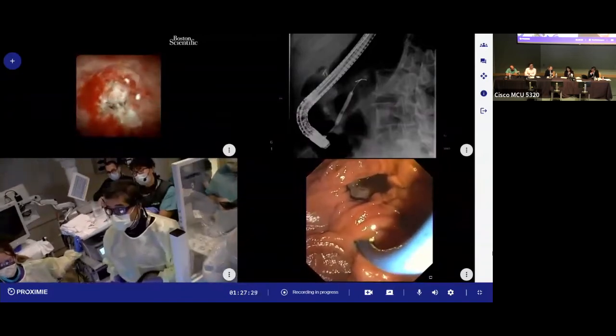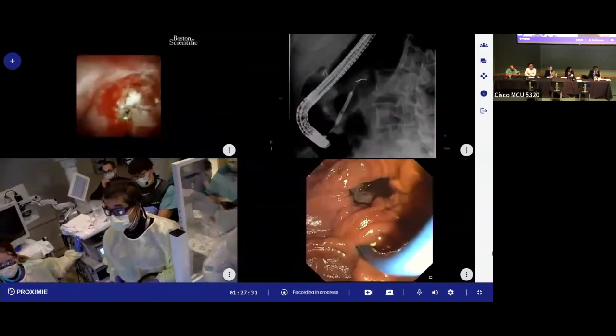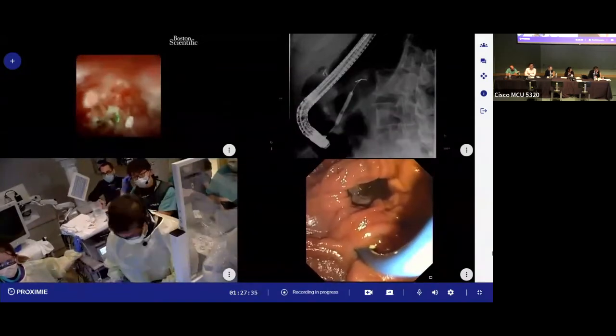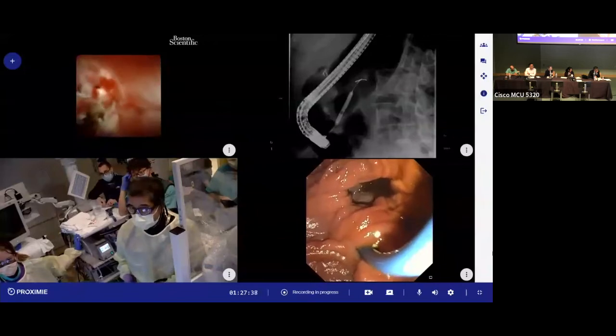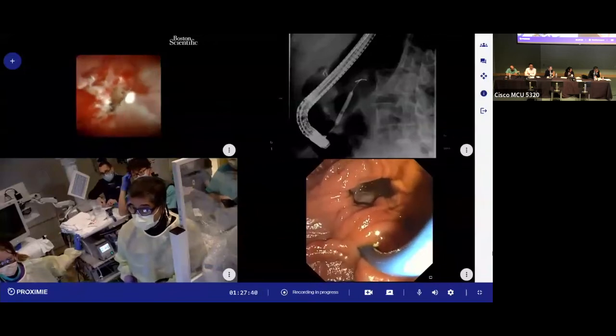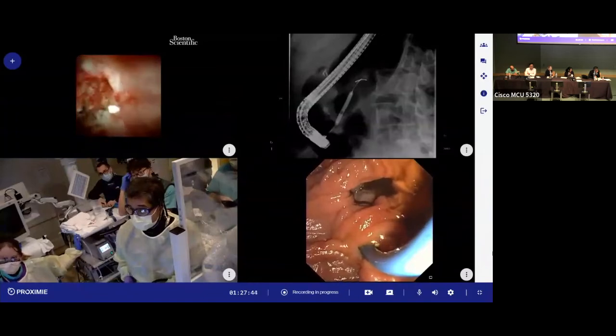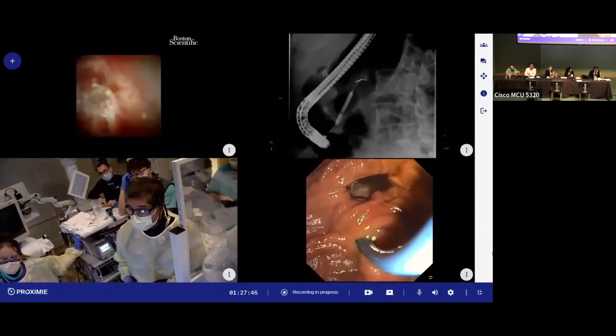So the green light is actually not the laser. That's just what I call the aiming beam. The laser itself, you'll hear some audible feedback. Do a little bit more here. Okay, irrigate here.